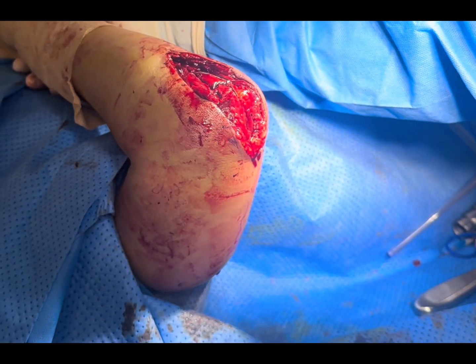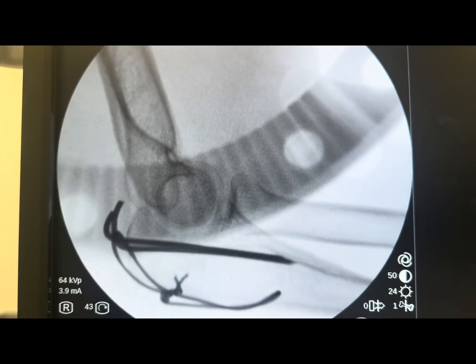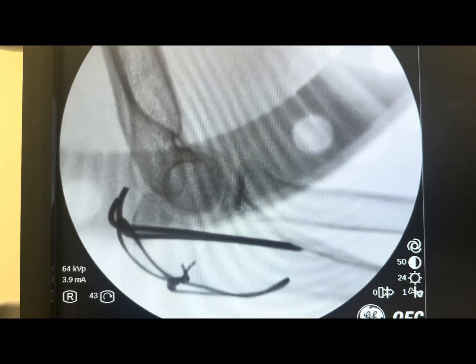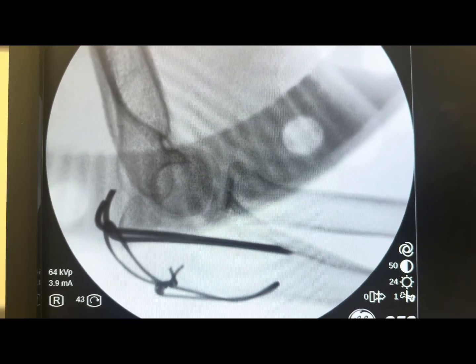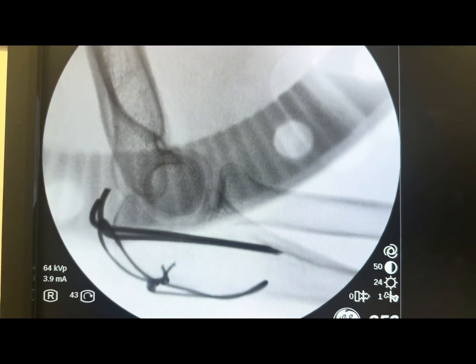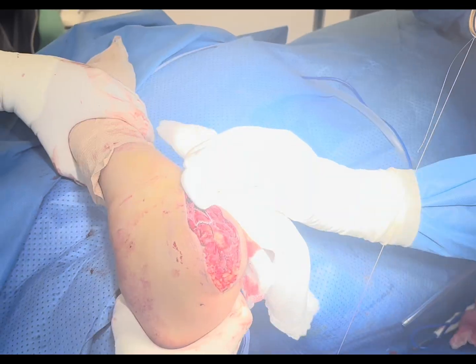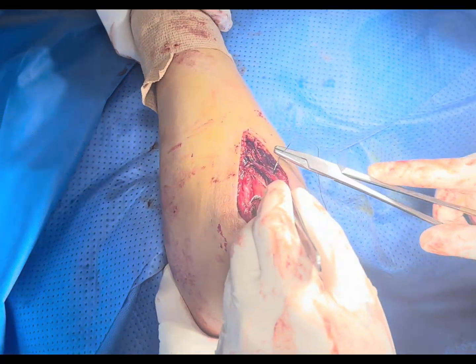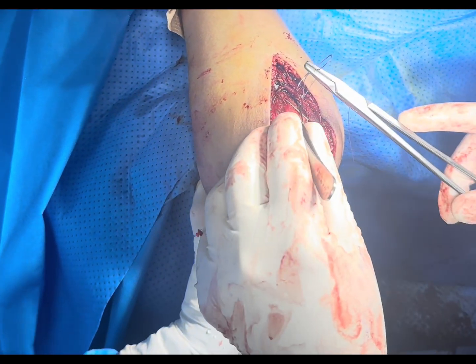Now we will take a wash and close the muscles and skin. This is the final X-ray. You can see the articular surface is well aligned and the K-wire and tension band wire are in situ. We have already checked the stability of the fracture — it is a very stable construct. Now we will wash the wounds and close the muscles and skin. Both medial and lateral aspects of the bone should be covered with muscles, otherwise it will cause pressure on the skin.